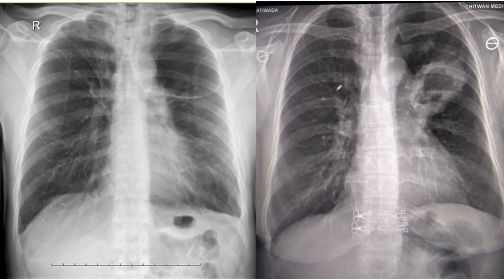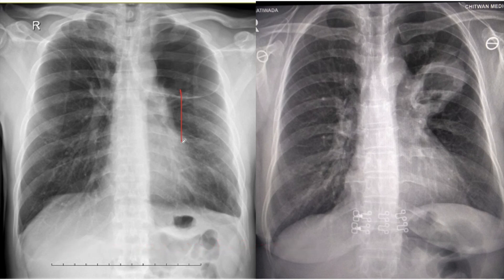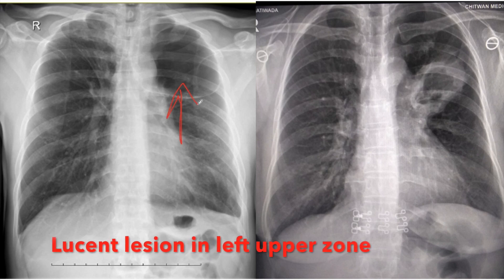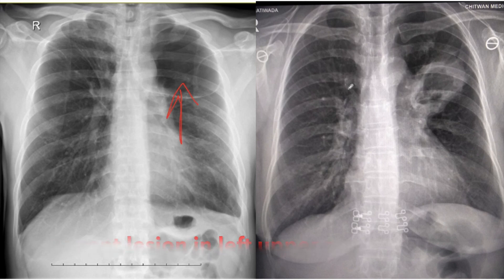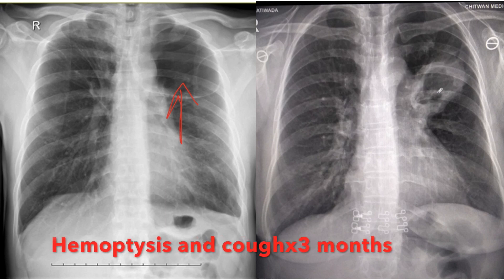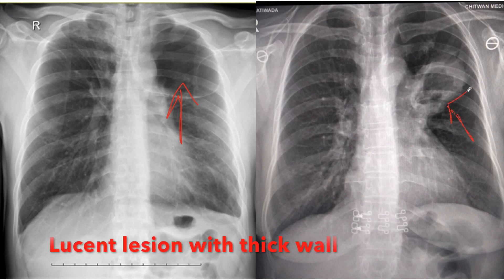Look at these two X-rays. The first patient presented with dyspnea and cough for three months, and we can see a lucent lesion in the left upper zone. The second patient presented with hemoptysis and cough for three months, and here we can see a lucent lesion in the left upper and middle zone with thick wall.